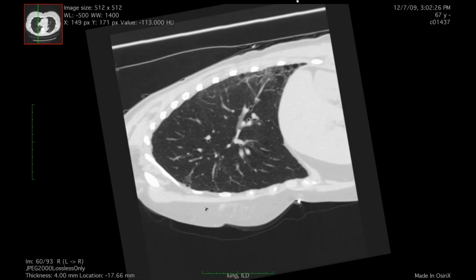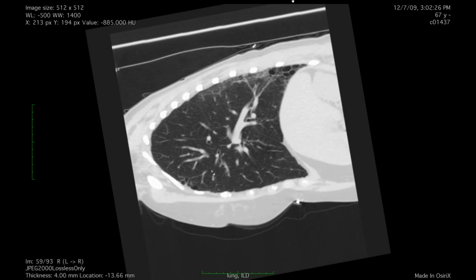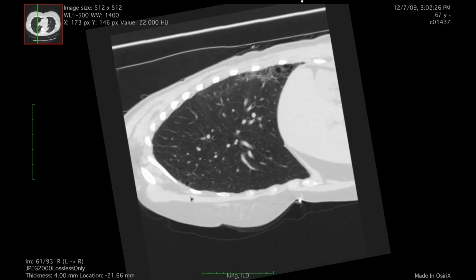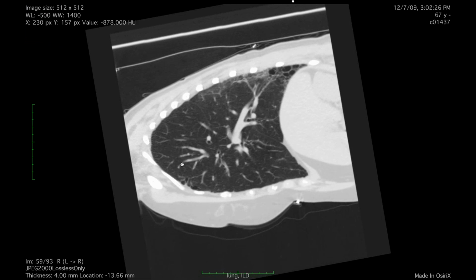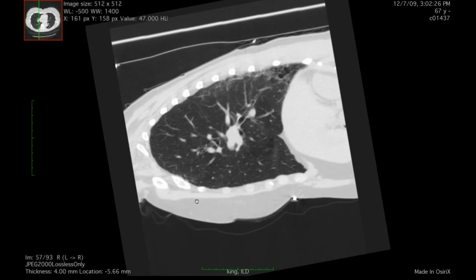We had a case, and I have it in my teaching files to show, of someone with pronounced anterior fibrosis, and he slept. They asked him, and he slept prone. Yeah. I should show that case because it was a really weird, bizarre pattern, and it turns out he slept on his belly. Within the last year, Jonathan wrote his paper on trying to differentiate connective tissue disease UIP pattern from IPF, and he talked about the anterior upper lobe sign, which I think, at least in the past, was anecdotally referred to as the four corner sign. But I don't know. We see that in all of these different diseases, though.